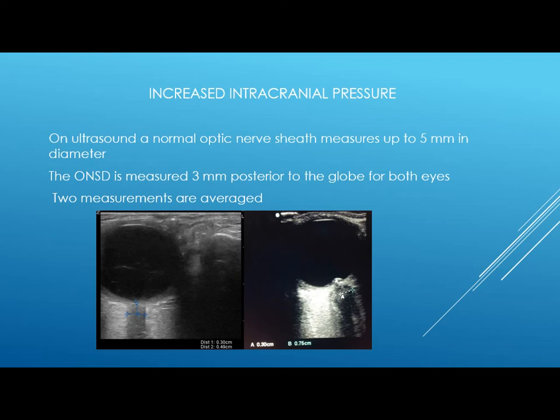Some texts say we take up to 6 measurements and average them, and some take only 2 measurements, the right and left, and measure both. And a result of more than 5 mm means increased intracranial pressure.